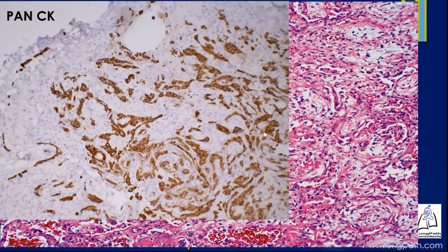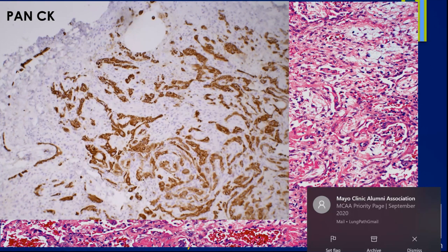If you do a pan-cytokeratin stain on this biopsy, you'll note that these are not all fibroblasts. There are quite a lot of epithelial cells mixed into this process. The lung is going to try to reconstitute its normal structure out of this morass of epithelial cells and fibroblasts. If you look under the electron microscope, the alveoli will try to reconstitute in experimental models, and you can watch this process happen.